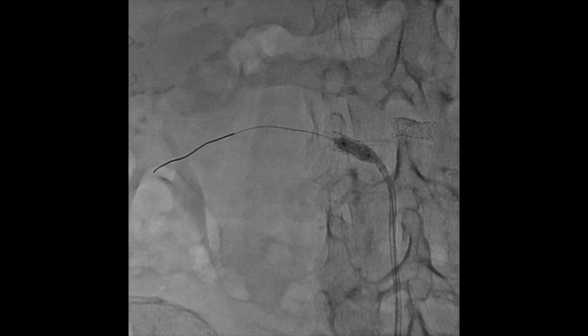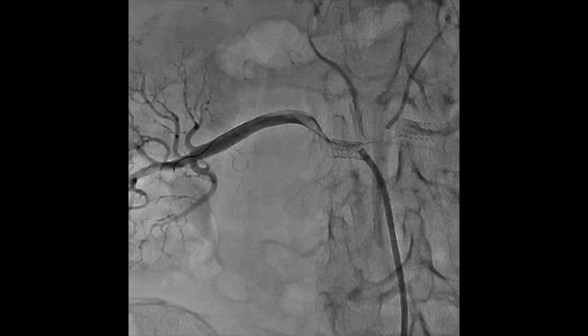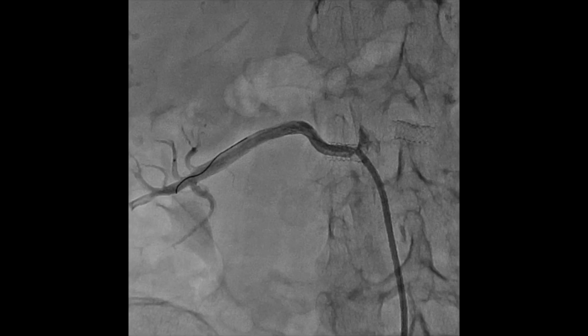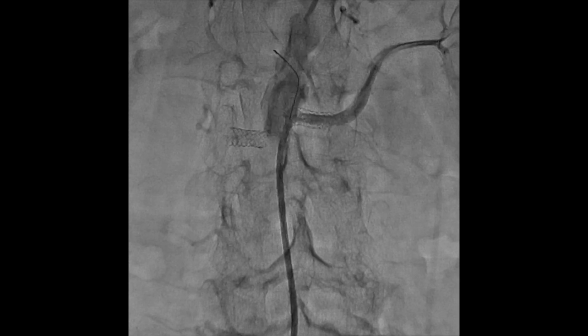Next, we dilate the stent with the same 5 by 20 millimeter NC track balloon. And this is the final result. Looks much better on the right side as compared to the left, but still left also has good flow as seen here.